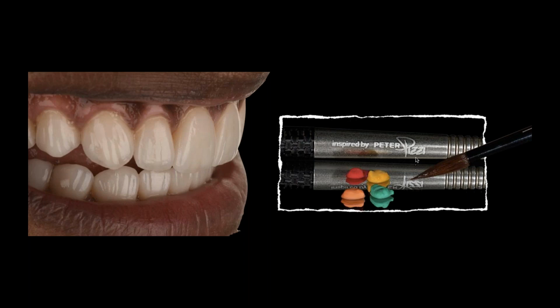So this is a first question. Do you change your facial texture and gloss by the age of the patient? 100%. Yes, that's a great question, actually. And whoever asked that, thank you. So it's interesting. The gloss that you refer to, the doctors, we all call it glaze, right? And I say glaze is such a bad term. It's such an archaic term to me. Teeth have luster surface to them, and every luster of the tooth is different. Some have very high luster, some have a lower luster, some have a lot of texture, some have a little texture. I'll add to your question by saying texture actually can increase value because you get more light reflection.